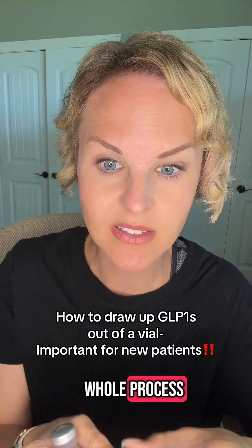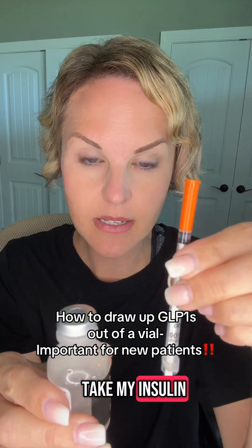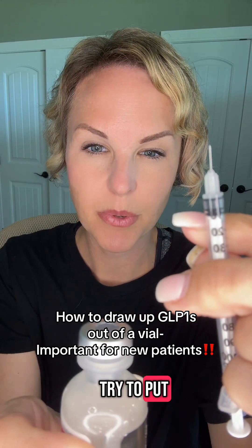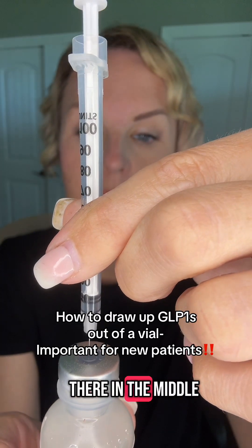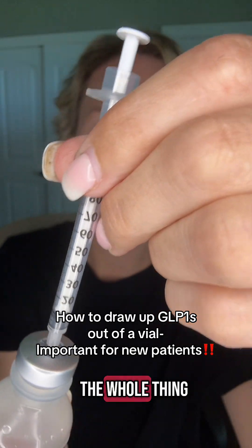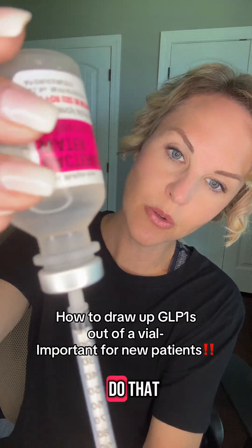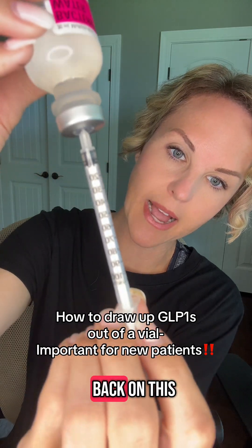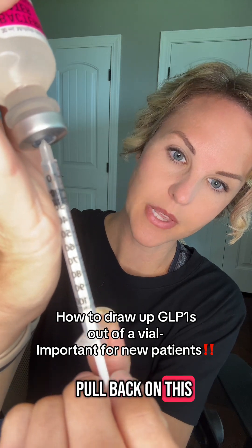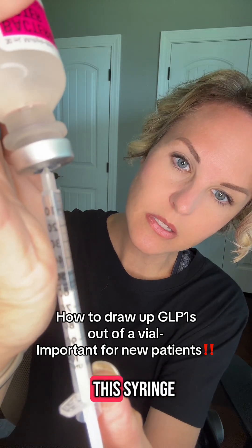Let me show you the whole process. Take the vial, use your alcohol swab and do a little wipe. Then take your insulin syringe, pull the cap straight up, and you can see the little tiny baby needle. Insert it right there in the middle at a 90-degree angle and push it in. Then turn the whole thing upside down, keeping it at a straight angle. When you do that, pull back on the plunger — you should feel a little tension, and you'll see medication pull into the syringe.